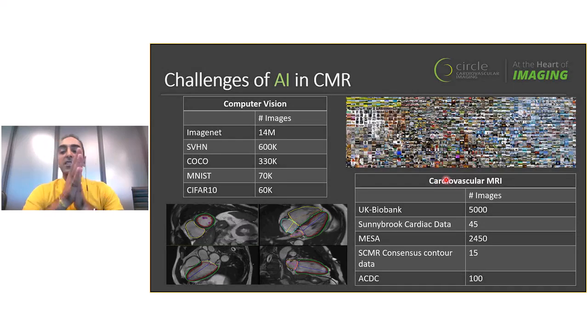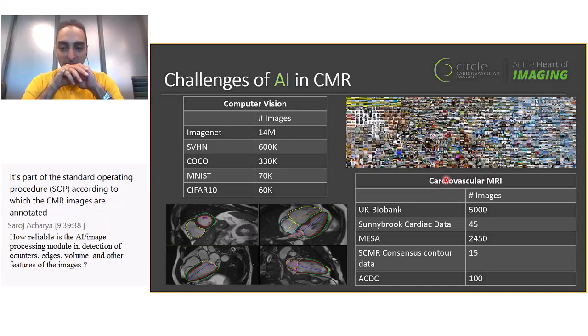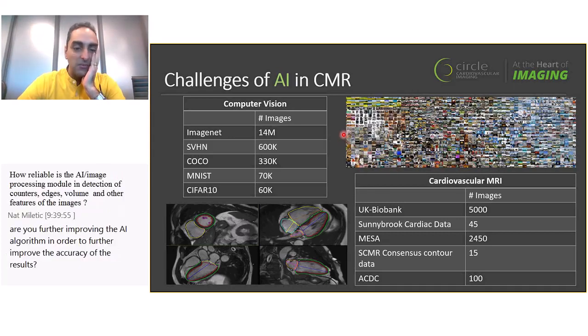Now, everyone is here to hear about AI in medical imaging, and I bet most of you are curious about the challenges that we face, not just the success stories and cool features that we put into our software. So when it comes to challenges, I think we can all agree that the biggest challenge in developing such AI techniques in the context of medical imaging is, of course, data. And what you're seeing here is the huge discrepancy that exists in publicly available databases for training such algorithms.